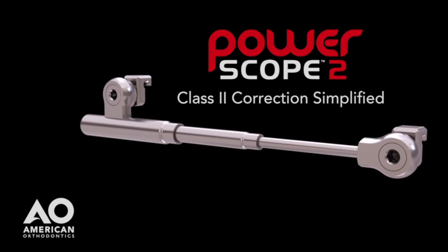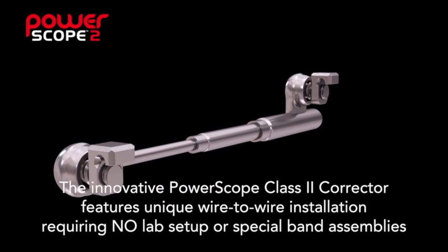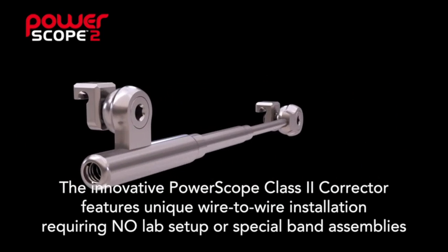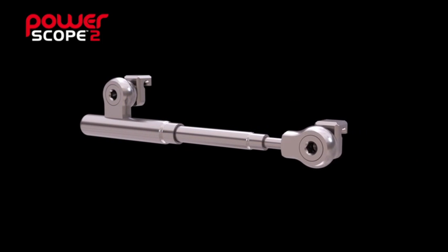PowerScope is an innovative chair-side solution for simple Class 2 correction. The appliance uses a unique wire-to-wire installation, going from package to treatment in just seconds. There's no need for assembly, lab setup, or special band assemblies, and it requires no patient compliance.